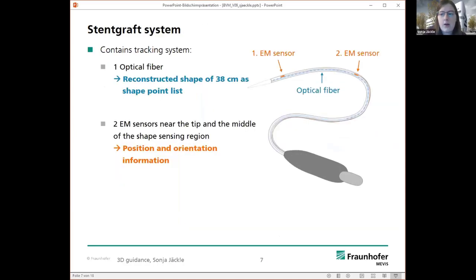So how have we done that? In this work we tracked a stent graft system. So we bought a stent graft system, disassembled it, and integrated the tracking systems. One optical fiber was integrated in the first part of the stent graft system. And this allows us to reconstruct the shape of the 38 centimeters in the front region.